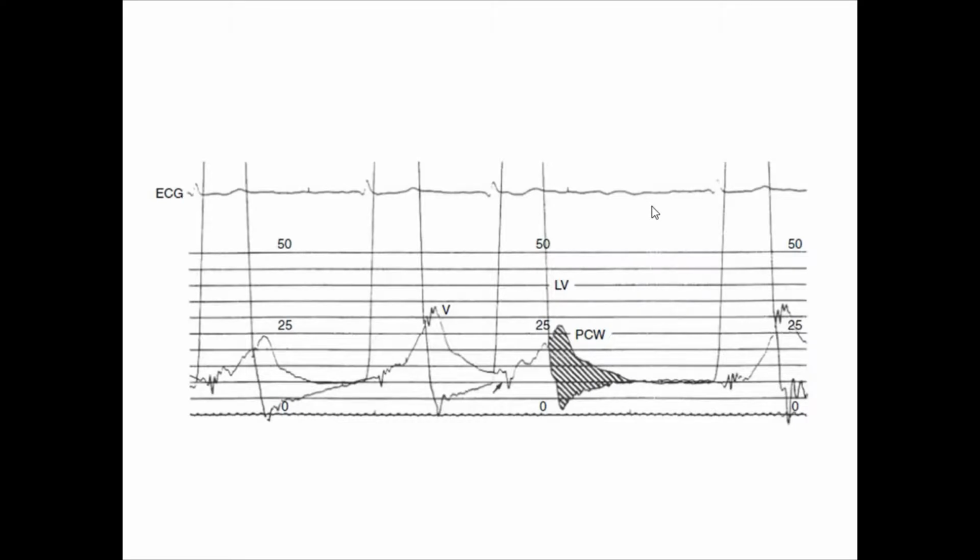What other support, other than irregular heartbeats? What supports your diagnosis? Because if we look, this is systole, this is systole, this is systole, this is systole, this is QRS complex, QRS complex, QRS complex. It is completely irregular. So if I ask you what supports your diagnosis of atrial fibrillation in this tracing, I mentioned it earlier: there is no A wave. We will see only a high V wave, or there is a diminished A wave.